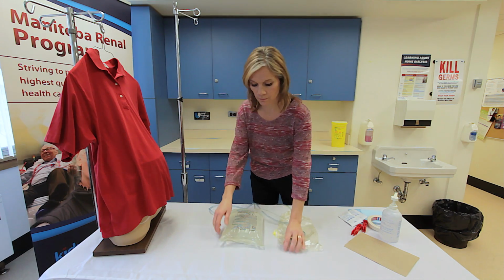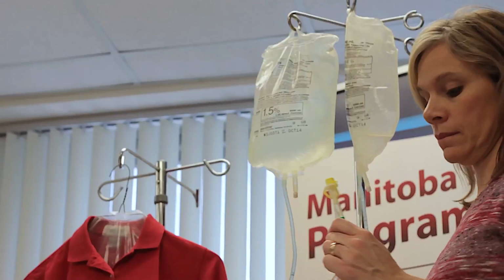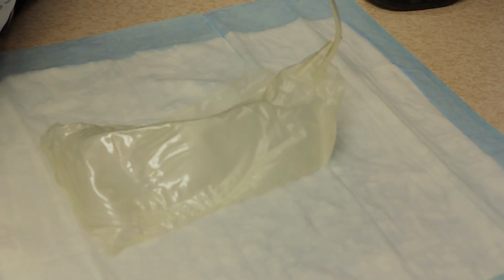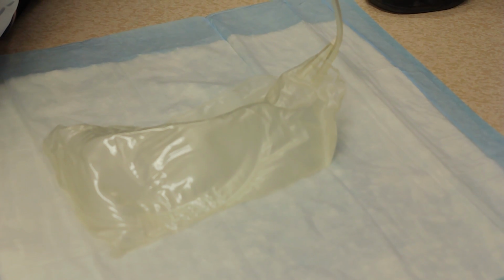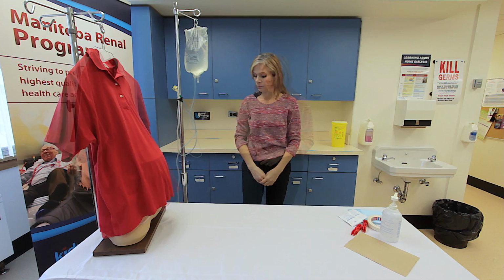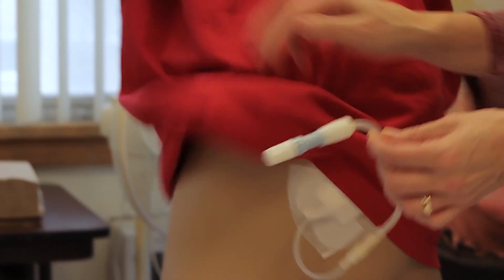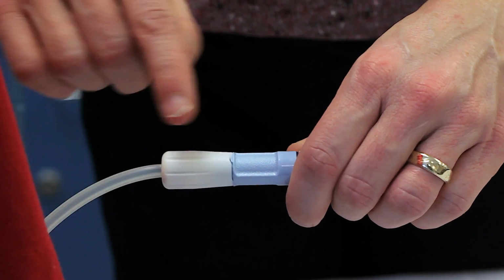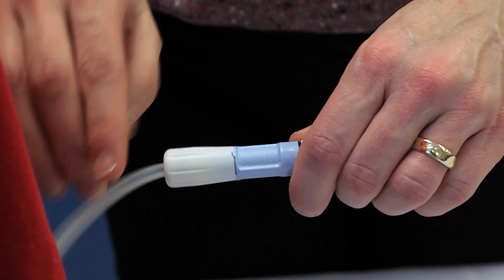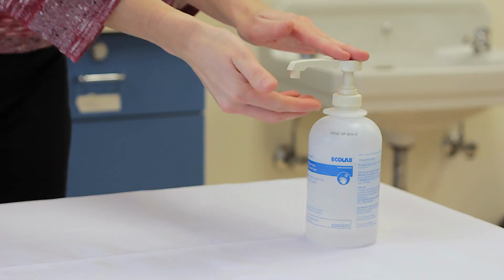Hang the dialysate bag on the IV pole and lay the drain bag on the towel or incontinent pad on the floor. Ensure the connector remains sterile. Remove the transfer set from under the patient's clothing. Ensure the twist clamp of the transfer set is closed. Perform hand hygiene.